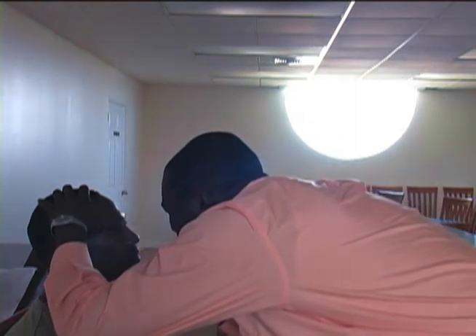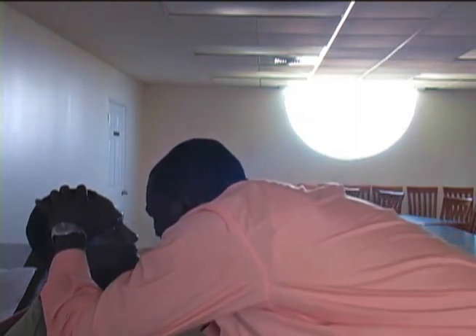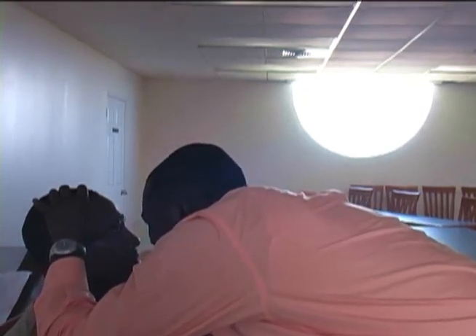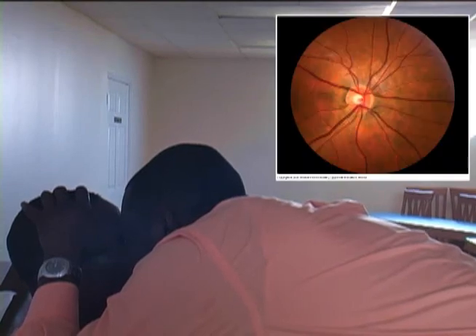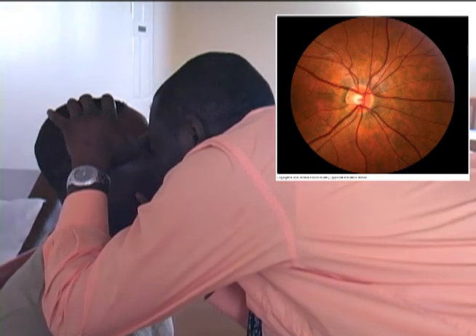Use the thumb of the opposite hand to gently elevate the eyebrow of the eye being examined. While maintaining the light on the pupil, move in close until the hand holding the ophthalmoscope rests on the patient's cheek. At this point, either a blood vessel or the optic disc should be visible.